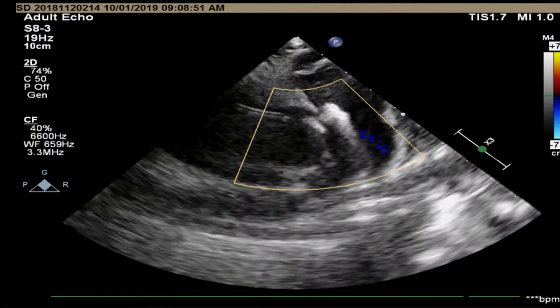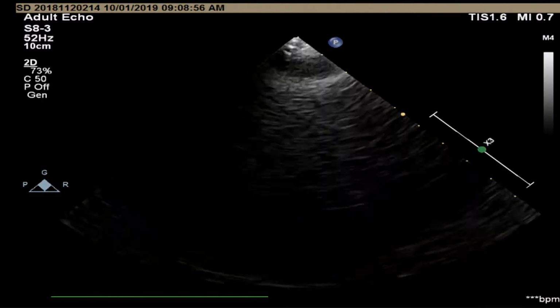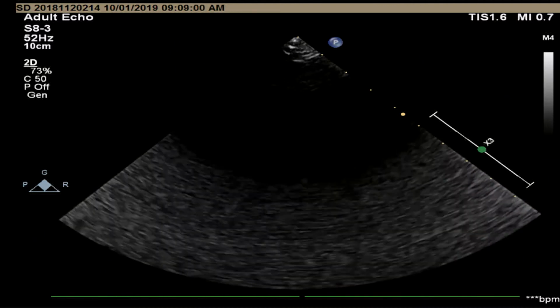RCA. Yeah, just one PA pressure I will get you.